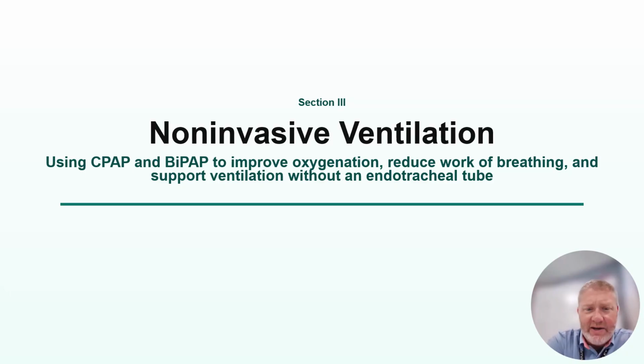Section 3 is non-invasive ventilation, so CPAP and BiPAP. Before I get to that, though, I want to clarify with high flow nasal cannula. You may hear in the field, especially from residents, that high flow nasal cannula provides PEEP. And while it does, it is not what you should use if you need to monitor the patient's actual PEEP.